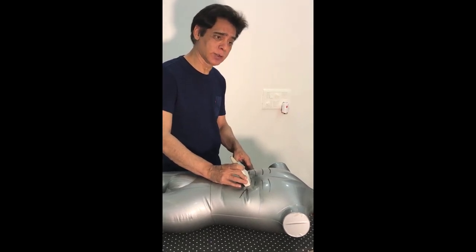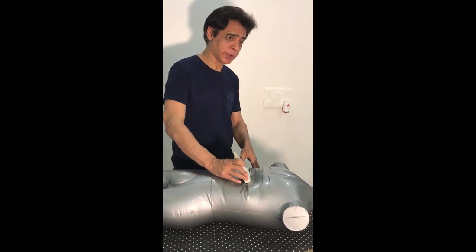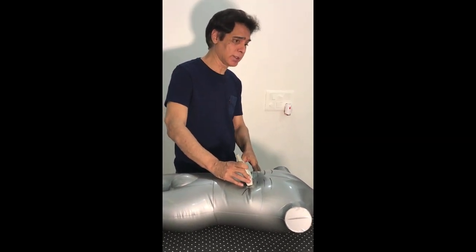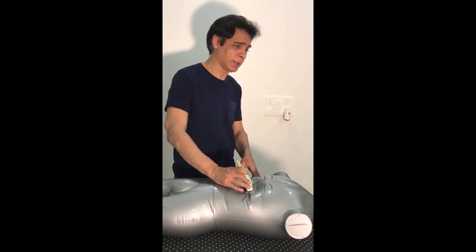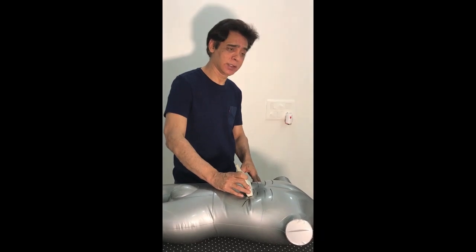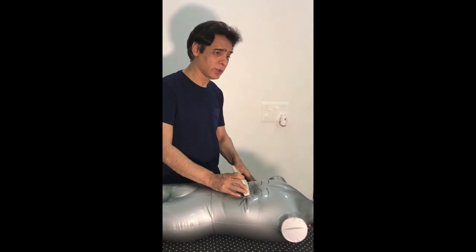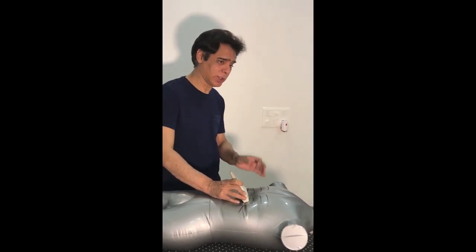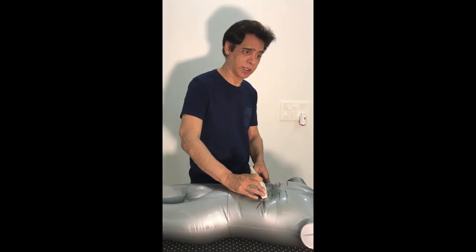A normal one is more difficult because of its smaller size. Anyway, as you can see in the pictures, so many times the distal part of the CBD within the head of the pancreas is not very conspicuous. It is quite small, and newcomers may face problems in identifying this part.